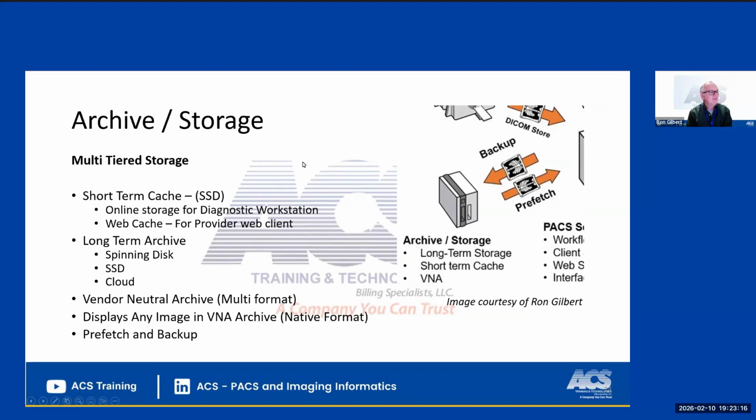Okay, archive storage. Right now, there's multi-tiered. That's the part where you keep your images stored and safe. That's the A in PACS, the archive.